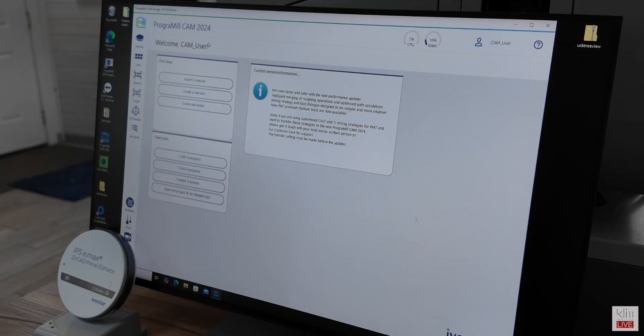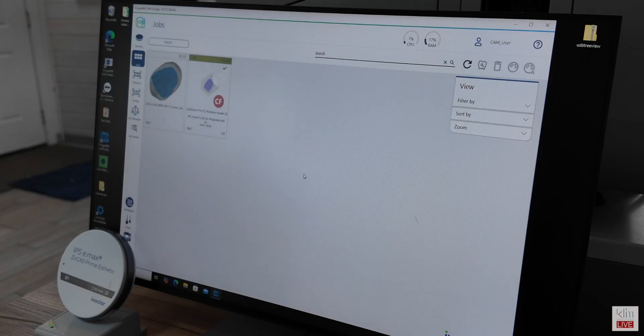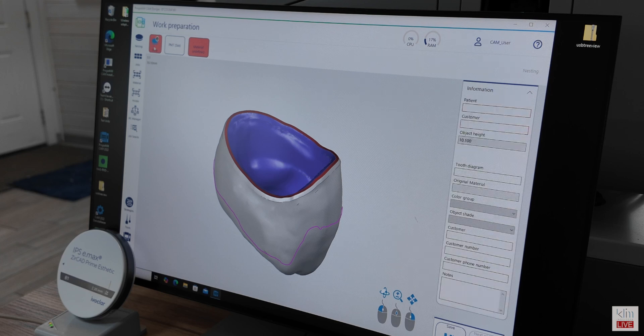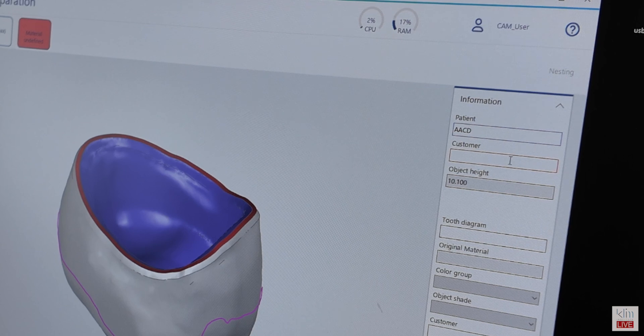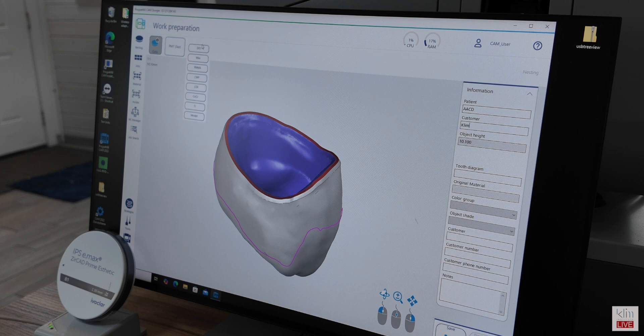Importing a digital file — an STL from one of your design softwares. Here we use ExoCAD. We import that into the system, double-click on that icon, and walk through the menu at the top of the screen. We're going to register with the patient name and the customer; that is required in the software. Once we have that accomplished, we're going to save, and now we're ready to fully register as zirconia.